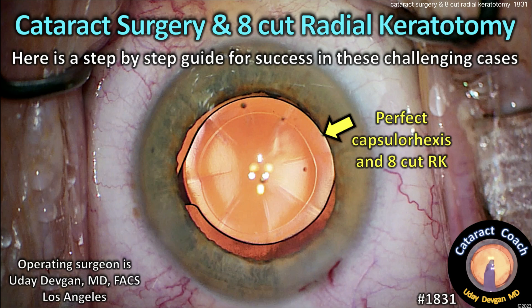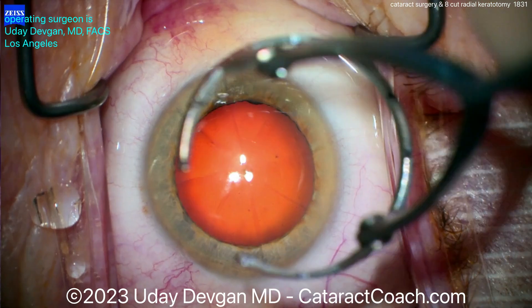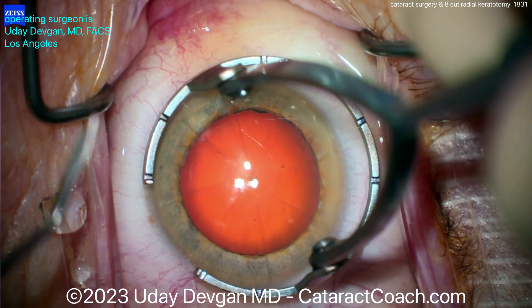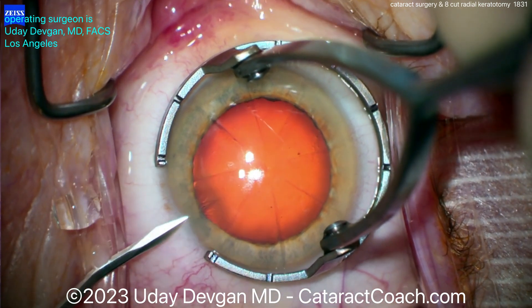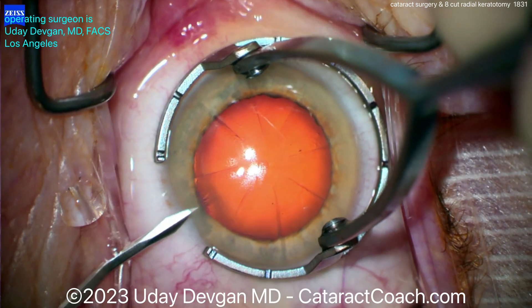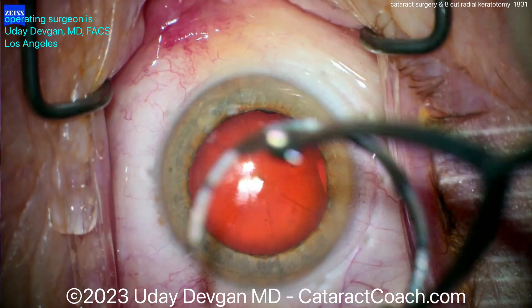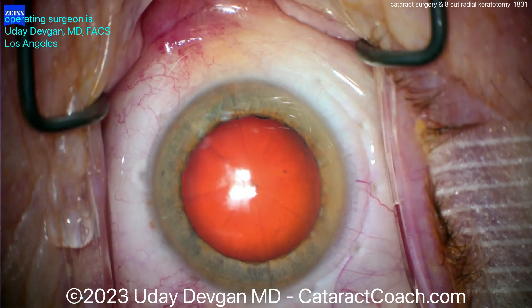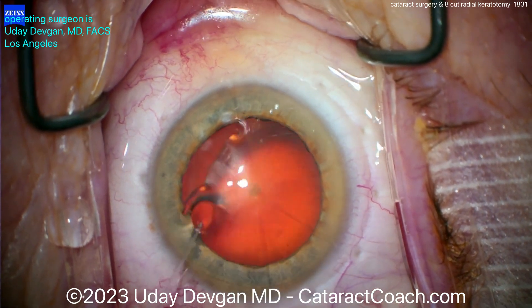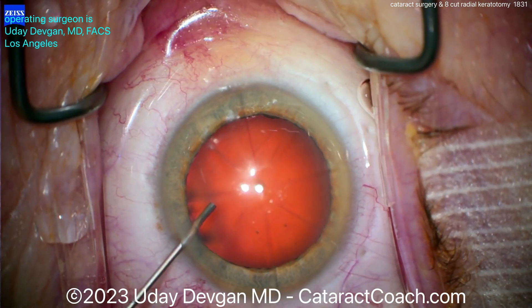CataractCoach.com — cataract surgery and eight-cut radial keratotomy. Here's a step-by-step guide for these challenging cases. This is my fourth cataract in an RK patient this morning. I do hundreds of these patients per year, and I know most ophthalmologists only do one a year. I have an unusual experience in that regard — thousands of these patients done.